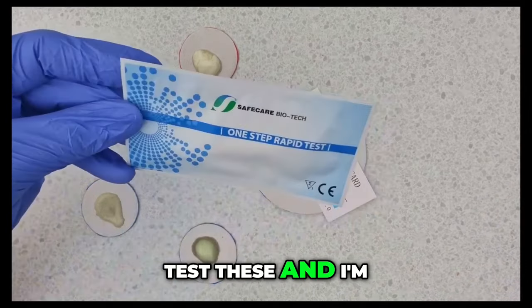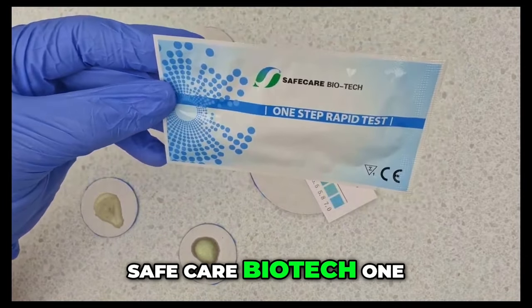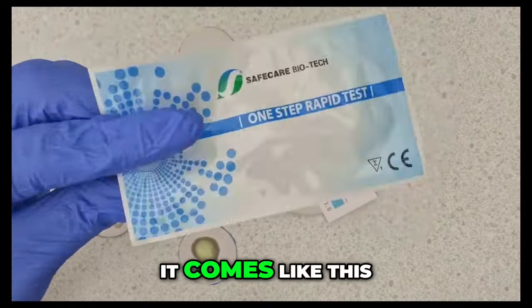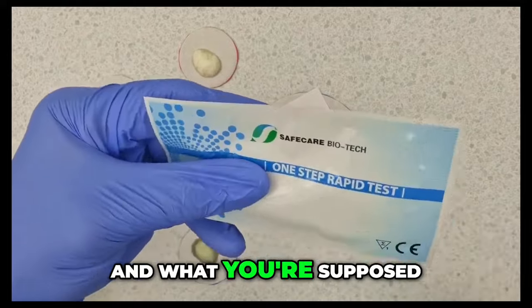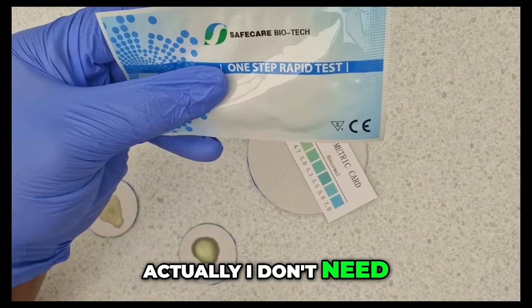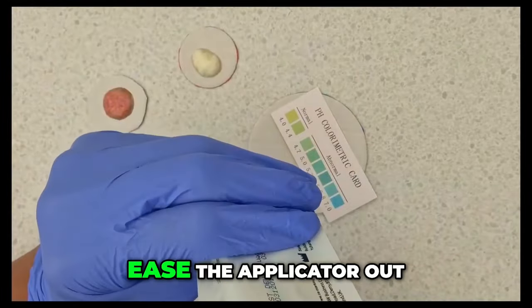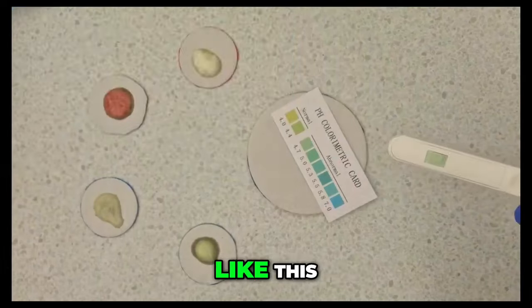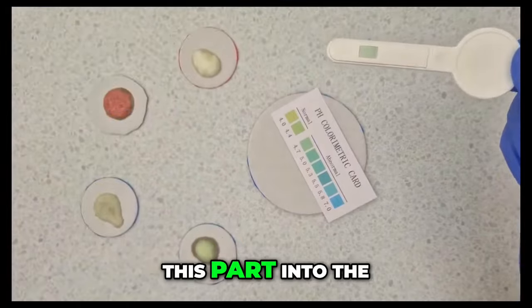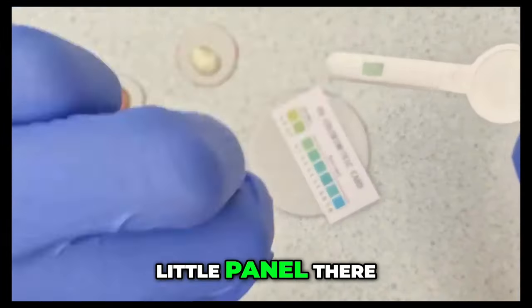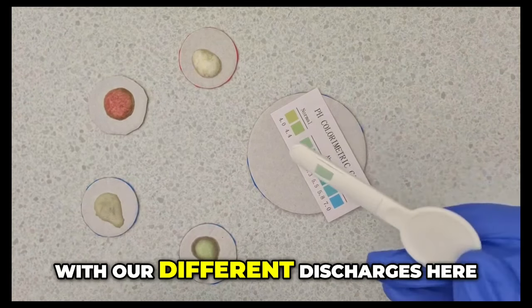So this is supposed to be a useful tool for testing your discharge. And if it does show some abnormality using the pH colorimetric card that comes with the kit, then it suggests that there might be an infection and you're supposed to go and see your doctor. So we're going to test these and I'm using this particular one for no reason at all apart from it's one of the many that you have on the internet. This is a safe care biotech one-step rapid test. So you can open this very simply and ease the applicator out. Held like this you're supposed to introduce this part into the vagina and moisten that little panel there with whatever discharges within the vagina. So that's what we're going to do now with our different discharges here.